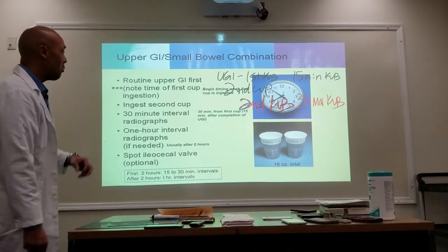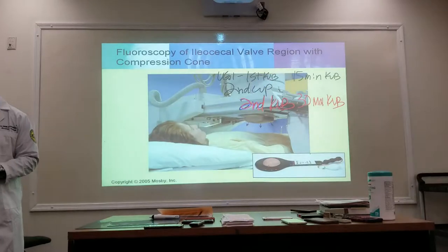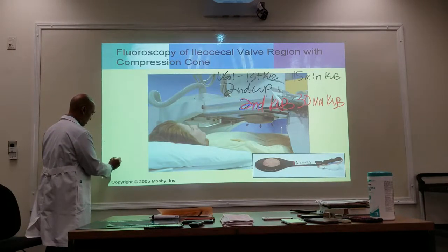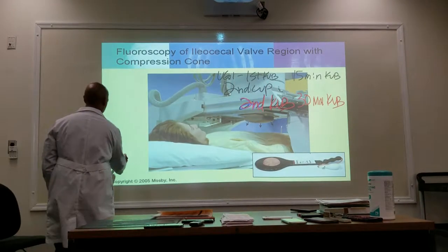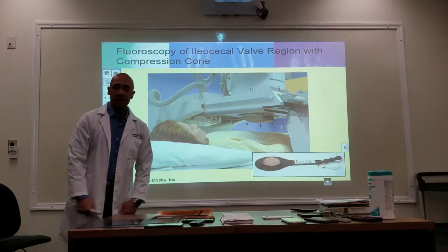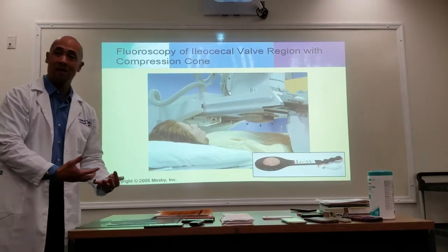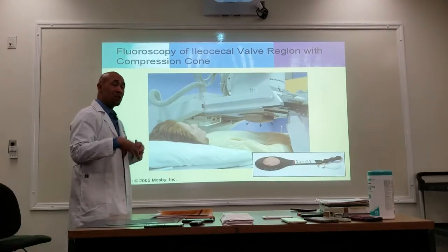But to be sure that we're in the right place, once the contrast fills that vicinity, the doctor is going to come in and do his spot image using the fluoro machine. So the doctor is going to come in and use this fluoro machine to look at the junction between the small bowel and the large bowel, and what is that area called? The ileocecal valve.